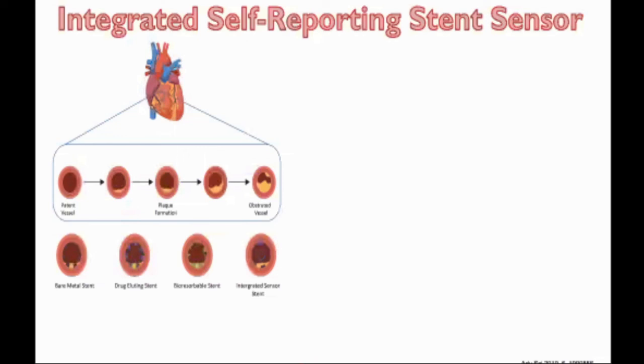So early diagnosis of in-stent restenosis is currently almost impossible, and it relies on the patient having significant chest pain or, worse, a second cardiac event. Those patients fortunate to have their ISR detected still rely on lifelong medication that may require subsequent PCI with additional DES deployment or drug-eluting balloons. So a solution are stents with integrated sensors that can detect growth of cells, the different cell types, and that can measure changes in flow and pressure across the lesion site.